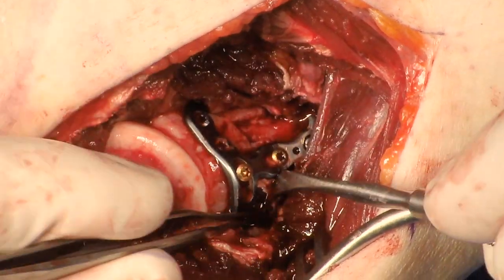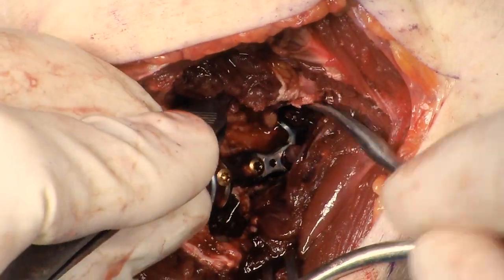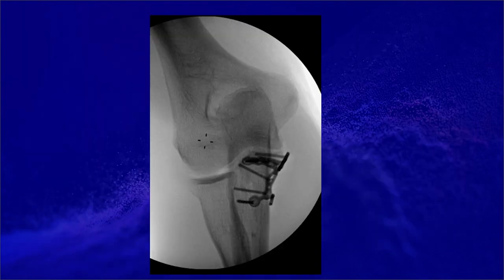Fracture reduction and plate placement is then assessed. The elbow is placed through a full range of motion to make sure there's no block to motion. X-rays show appropriate position of the plate as well as appropriate reduction of the fracture. There is one screw that looks like it's going into the joint, but you can see on the lateral that screw is posterior to the joint. It is important to perform an external rotation view to confirm that none of the screws are going into the proximal radial ulnar joint.